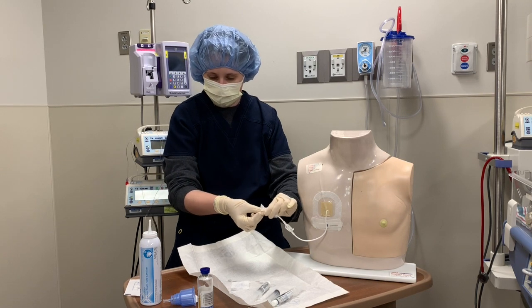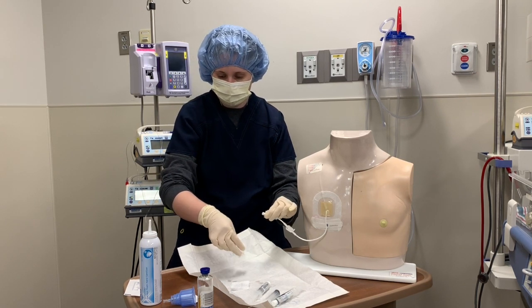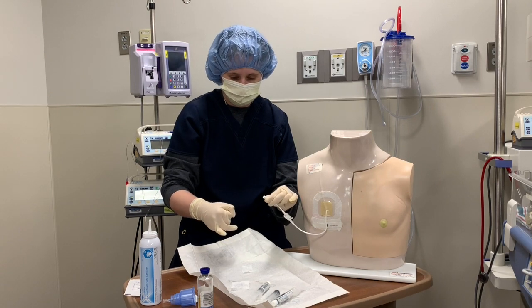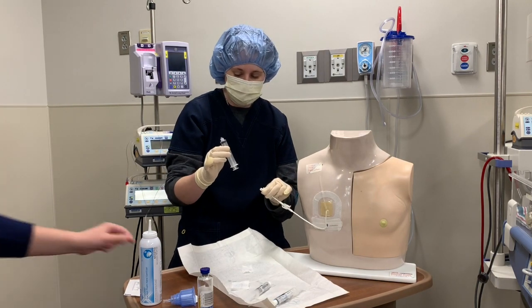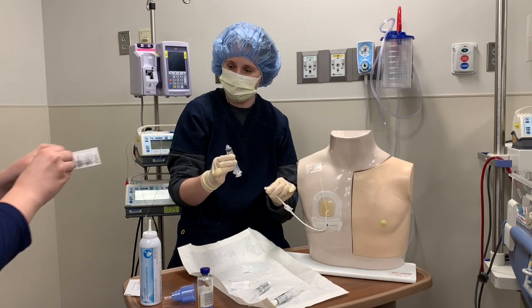One step I didn't do — which is why you always have a second person — is I didn't drop my new clave onto my sterile field when I prepared. So, Christina, can you open that and drop it for me, and maybe help me connect the syringe? That's why, even when you've done this many times, it's always good to have that second person.